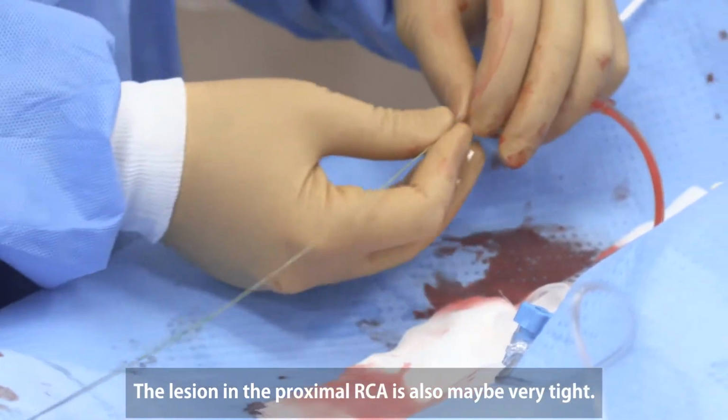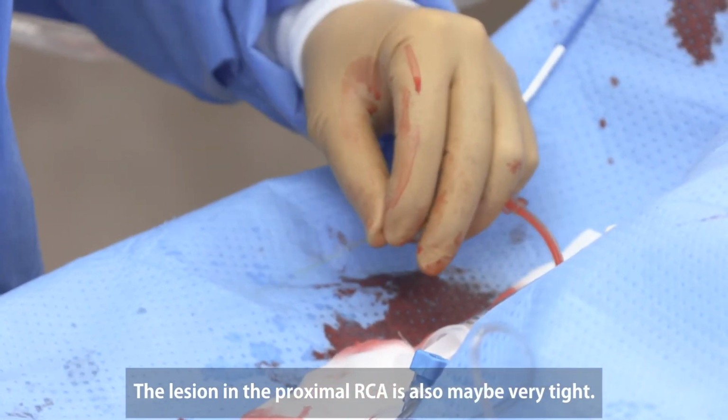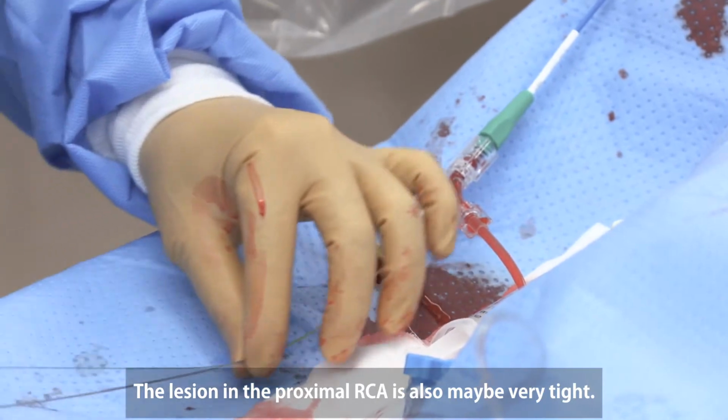The lesion in the proximal RCA is also maybe very tight.